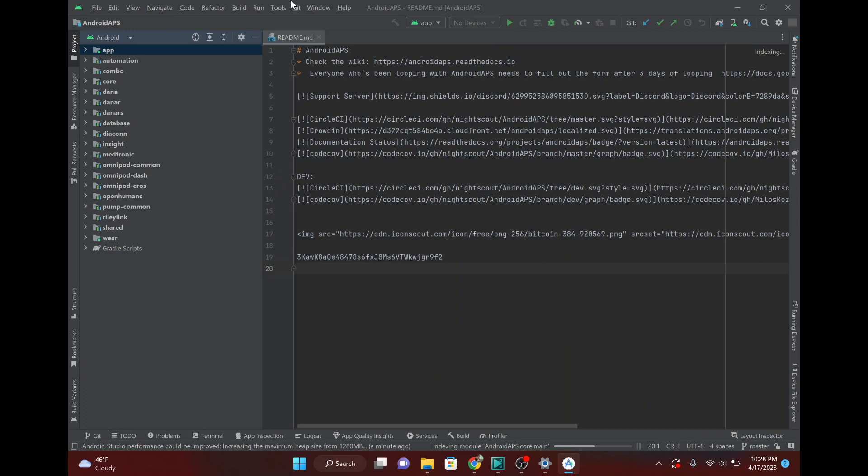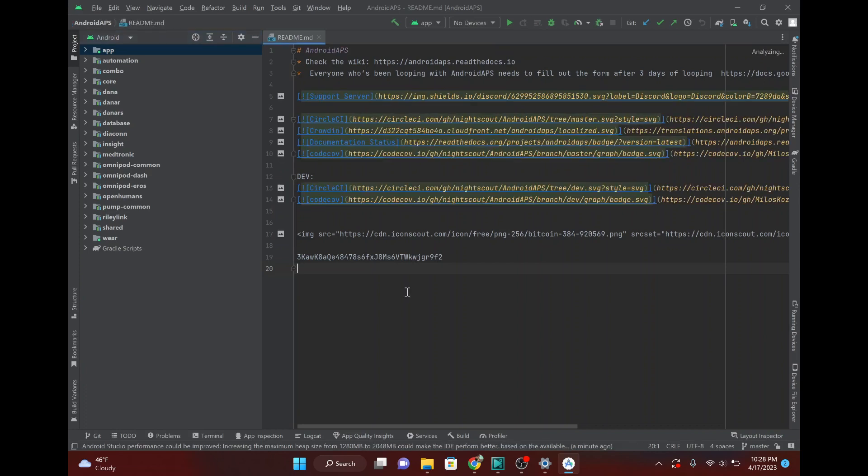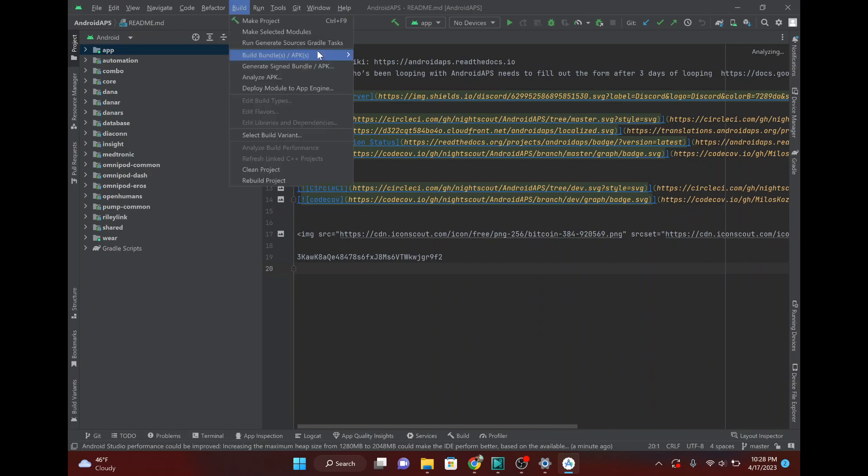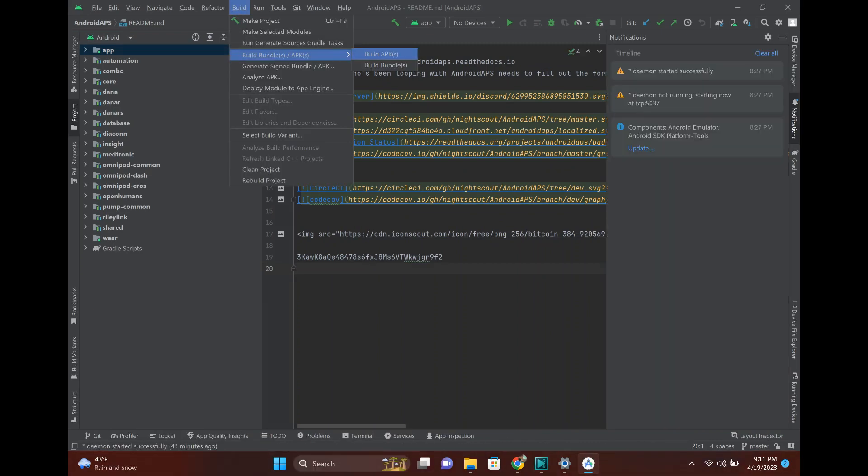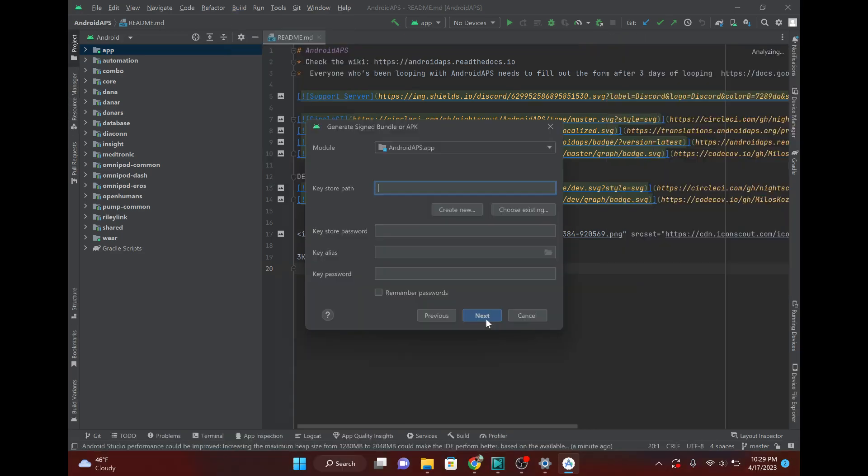And what you want to do is, you want to hit Build. Sorry, you want to hit Build, and you want to Build Bundles, or sorry, Generate Signed Bundles slash APK. And you want the full APK, not just the Android app bundle. So, hit APK.